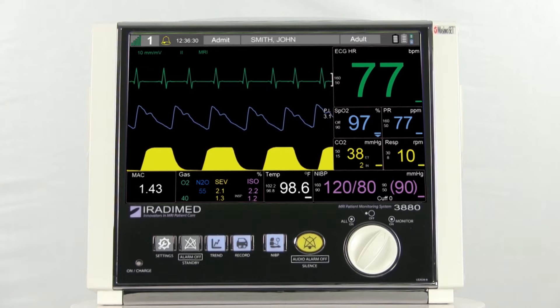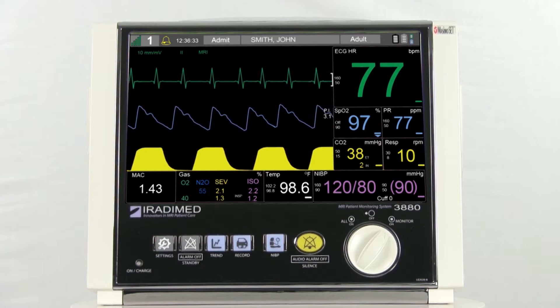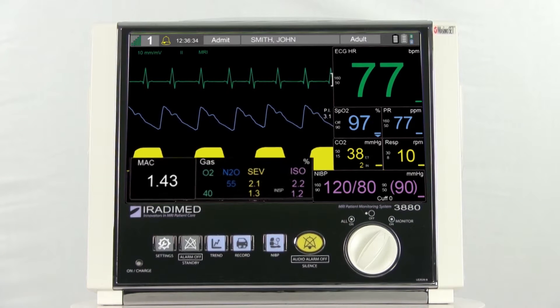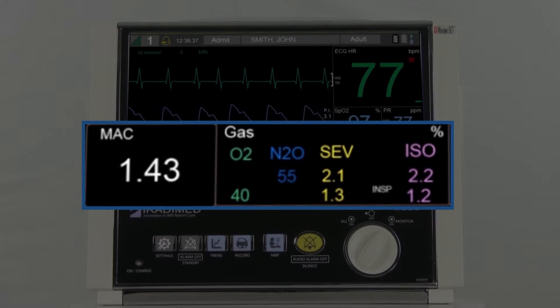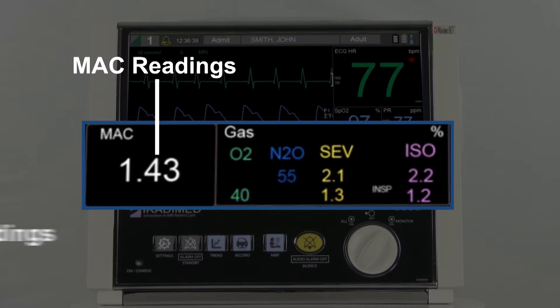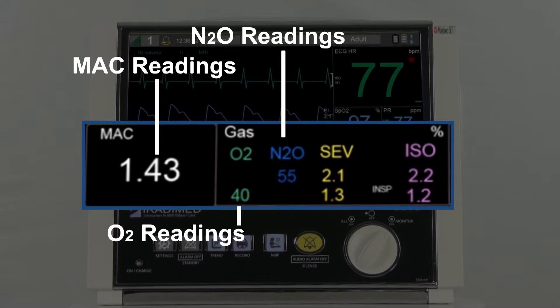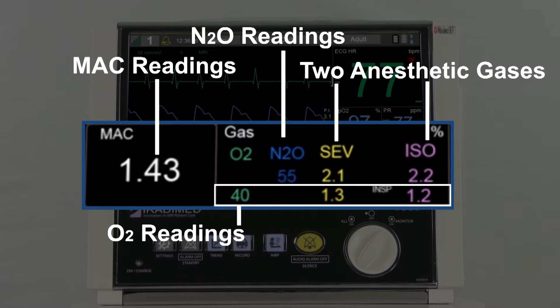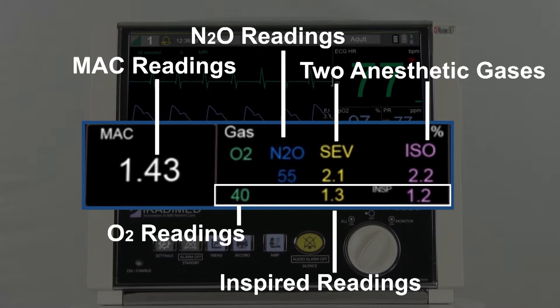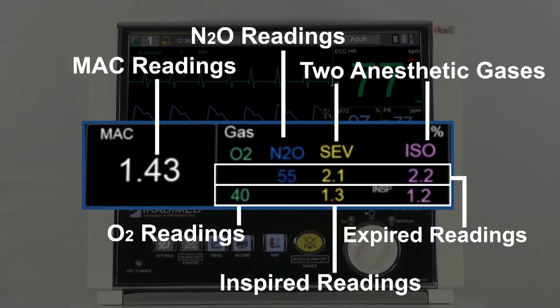Gases and minimum alveolar concentration, or MAC readings, will be displayed in the lower left corner of the patient monitor's display. Here the user will see the MAC readings, the oxygen readings, the nitrous oxide readings, and up to two simultaneous anesthetic gases. The bottom set of numbers listed are the inspired readings, and the top set of numbers are for the expired readings.